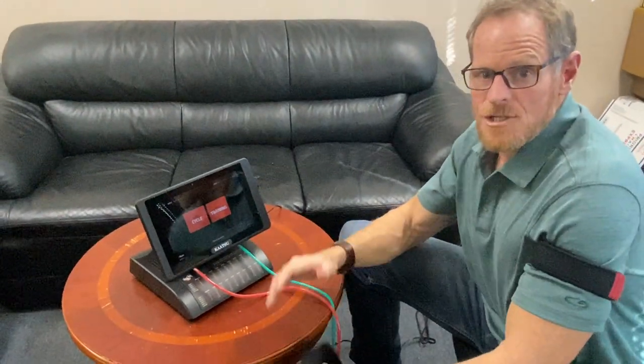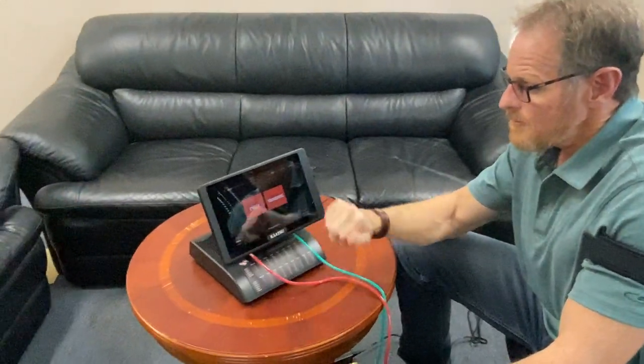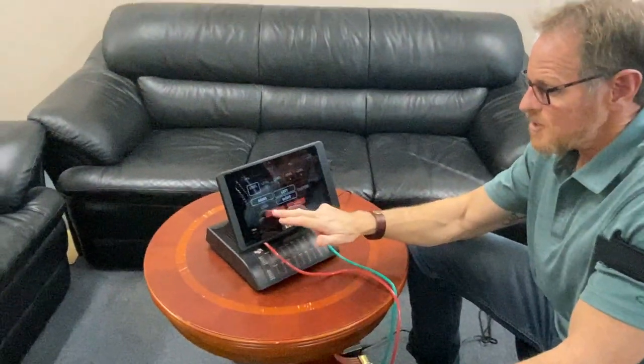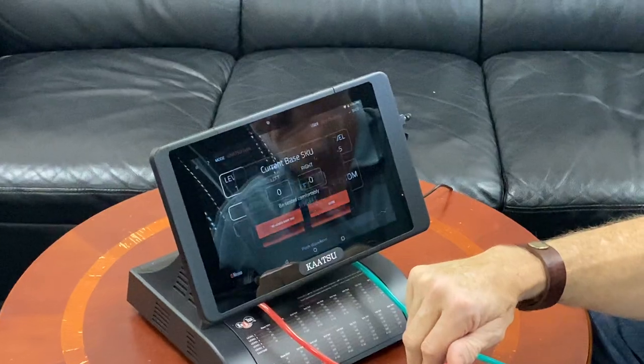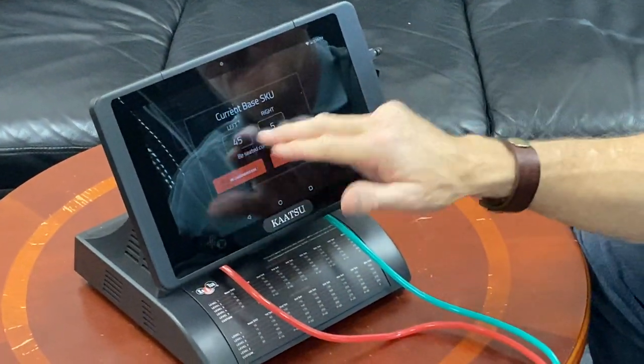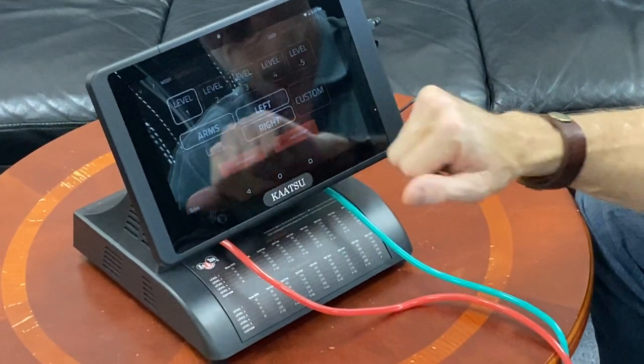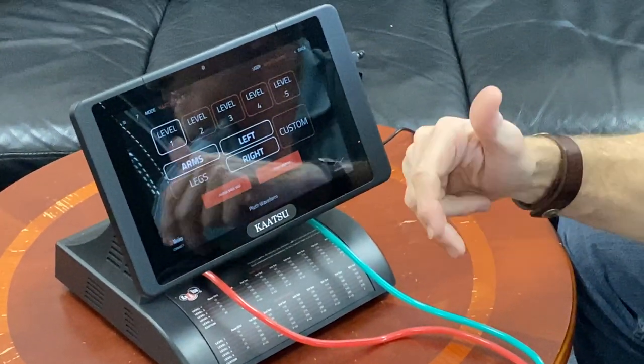A couple of troubleshooting items with the Master 2.0. If when you hit cycle and check SKU, you don't hear that little blast of air or you don't see any activity on the screen, that just means the pumps need to be reset.